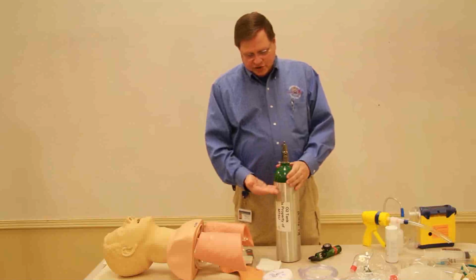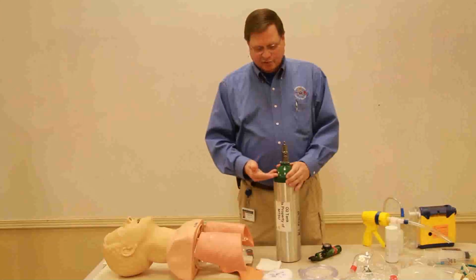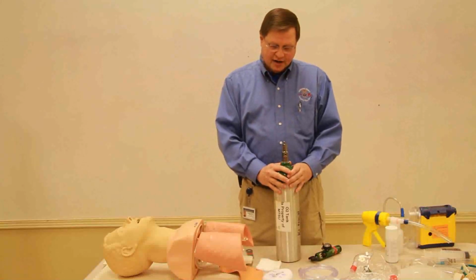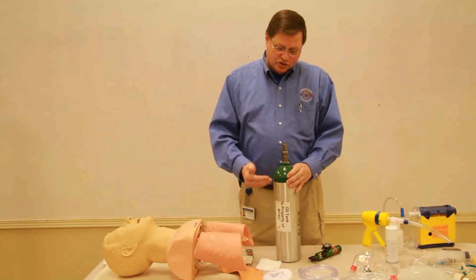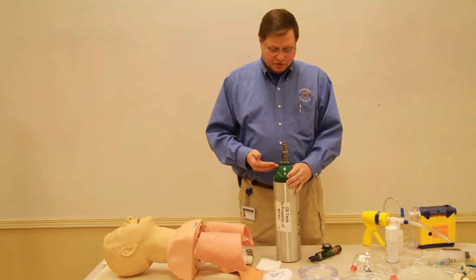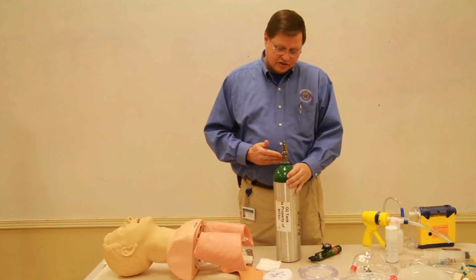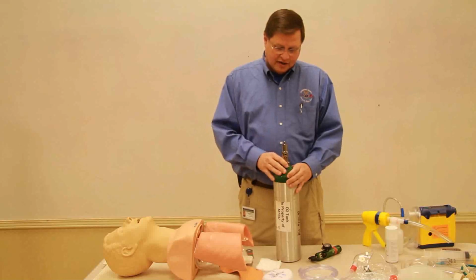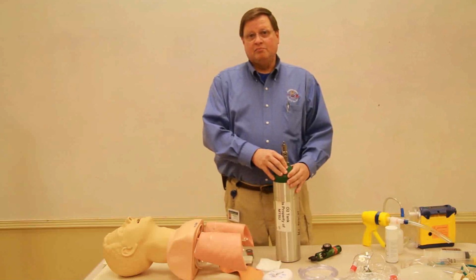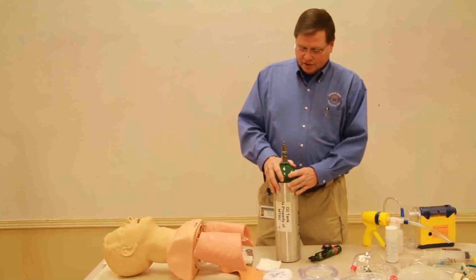What is important to remember is that oxygen is under a lot of pressure. It's under 2200 PSI, pounds per square inch. And so one of the dangers of this oxygen tank is that it is under so much pressure that if the nipple were to come off of this particular tank, be knocked off somehow from a fall or whatever, it would probably go through a couple of block and brick walls. So it's under a lot of pressure.